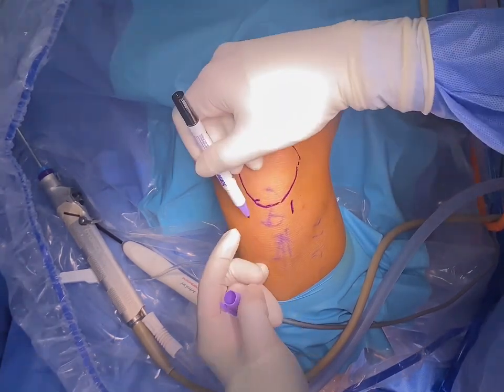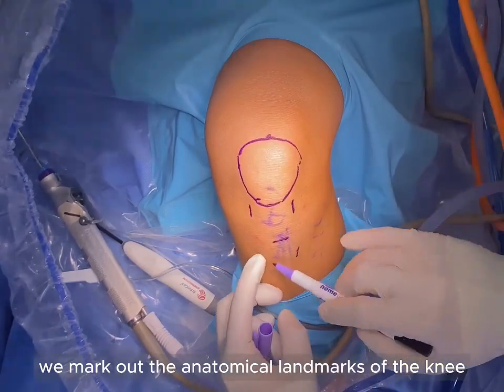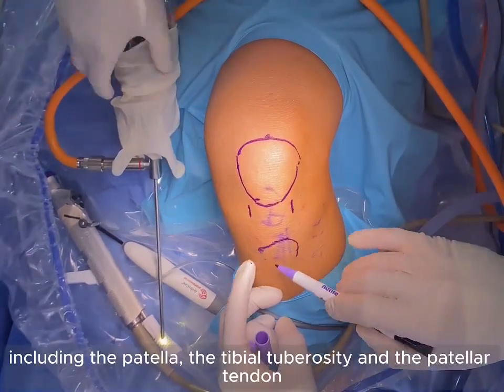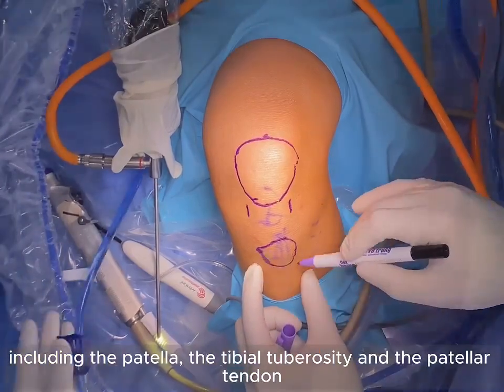Before incisions, we mark out the anatomical landmarks of the knee, including the patella, the tibial tuberosities, and the patellar tendon.